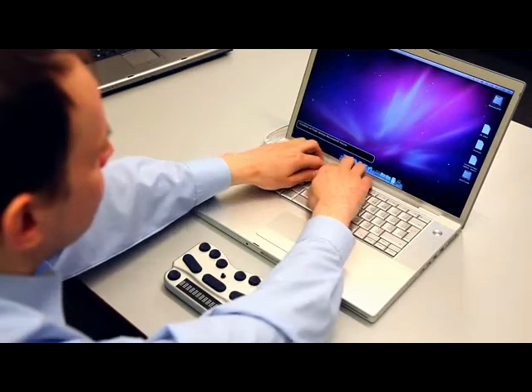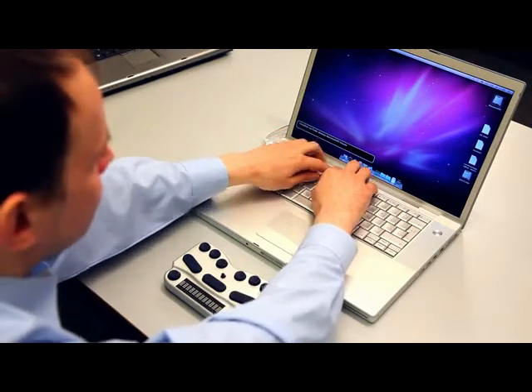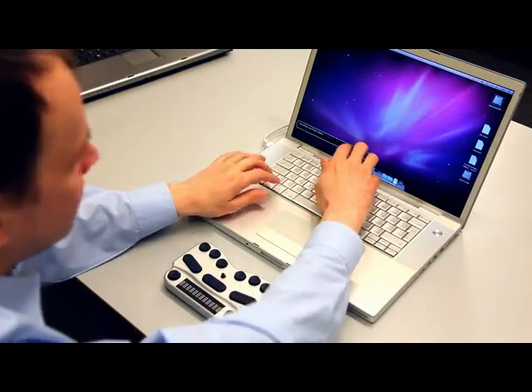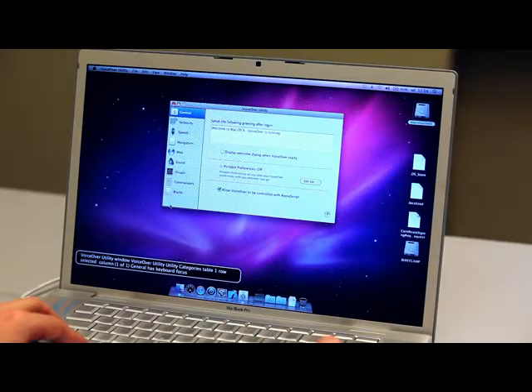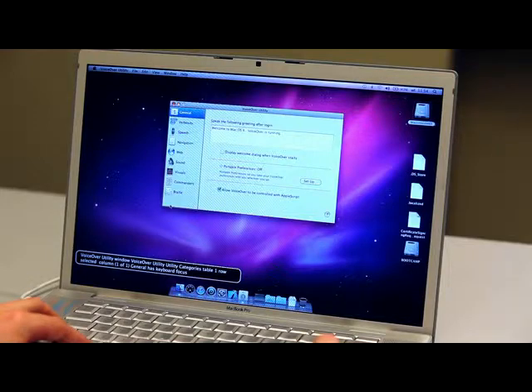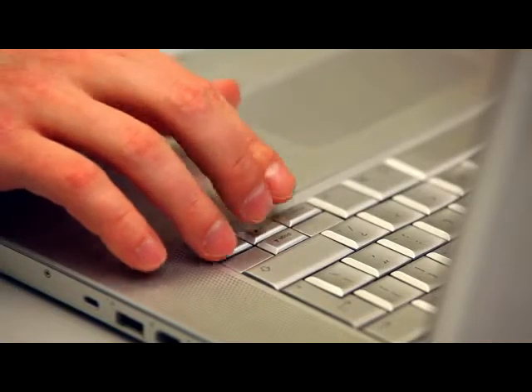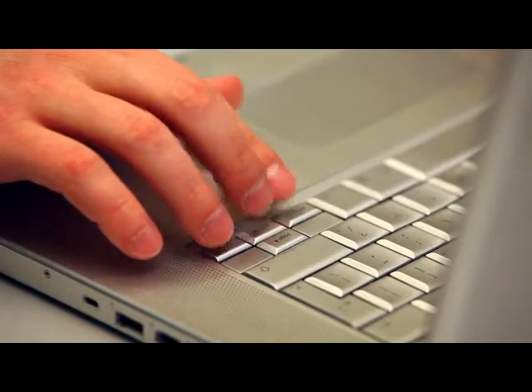Press Command F5 to activate VoiceOver on the Mac, or go to System Preferences, Universal Access, Seeing, VoiceOver, and change the radio button to On.